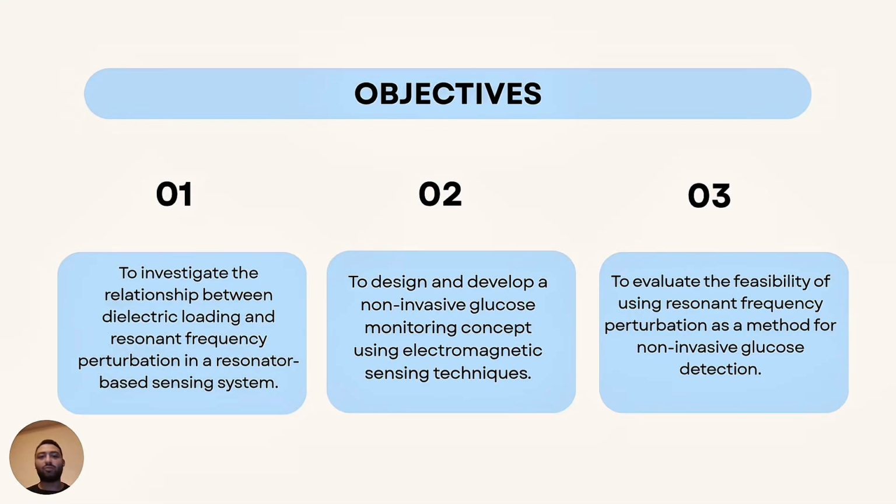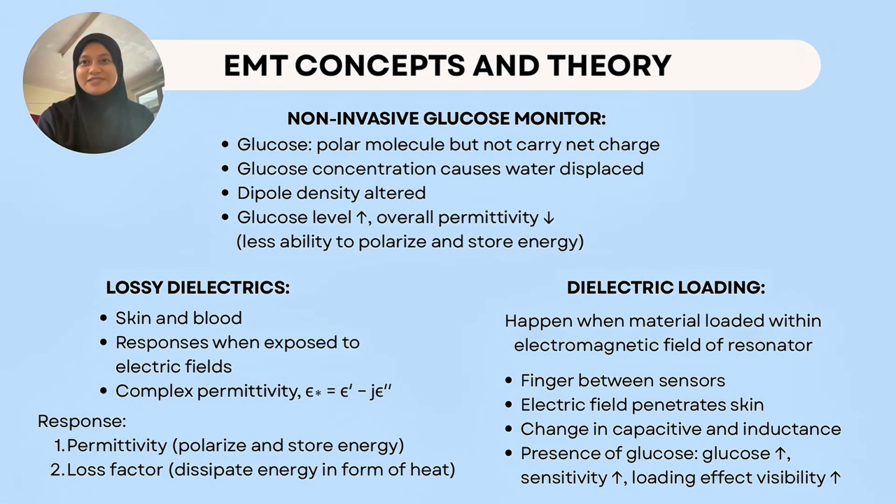So we have three objectives. The first one is to investigate the relationship between dielectric loading and resonant frequency perturbation in a resonator-based sensing system. The second is to design and develop a non-invasive glucose monitoring concept using electromagnetic sensing techniques. The third is to evaluate the feasibility of using resonant frequency perturbation as a method for non-invasive glucose detection. Next, we move to the concept and theory.